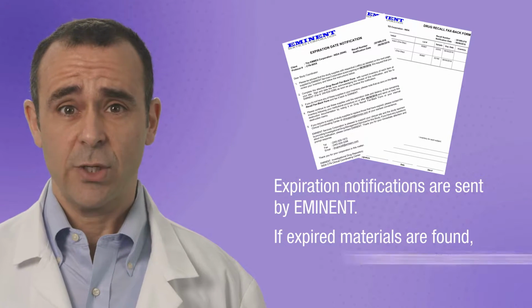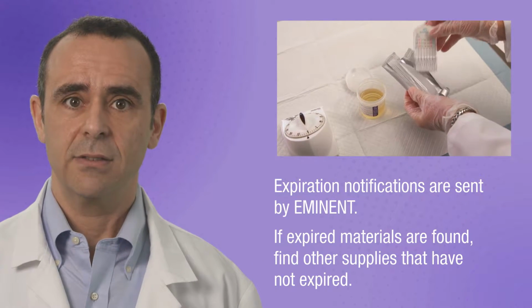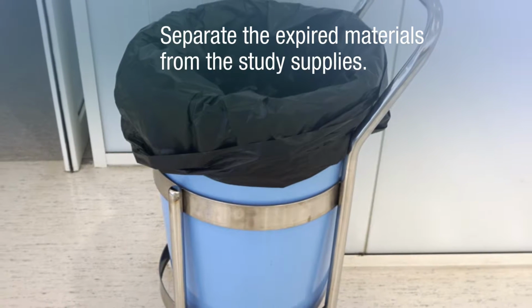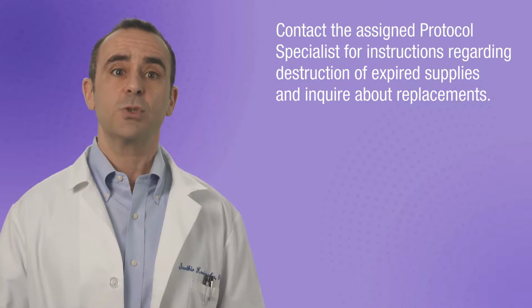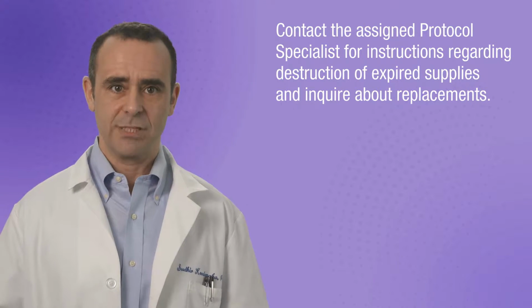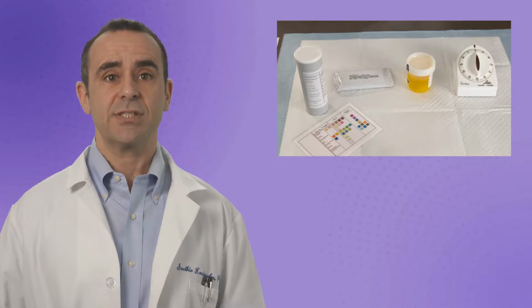However, if expired materials are found, try to find other supplies to use that have not expired and separate the expired materials from the study supplies. You may contact the assigned protocol specialist at EMMES for instructions regarding destruction of expired supplies and to inquire about replacements. Let's talk about the supplies needed for the urine drug screen testing.